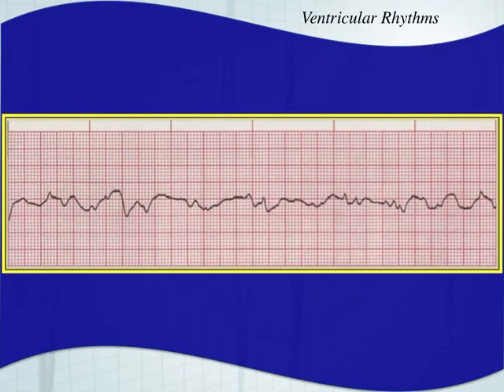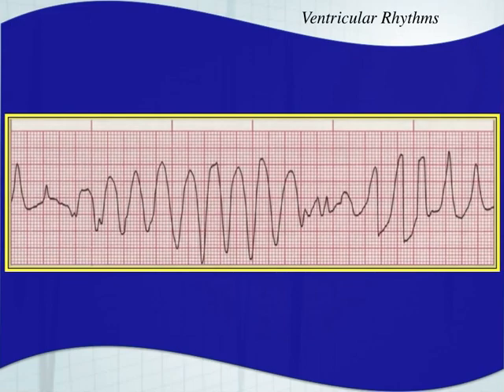Squiggly line, no organization, no P waves, no QRS complexes — that's V-fib. And looking at the next one again, you have that bow tie fashion — so we've got to think torsades de pointes.